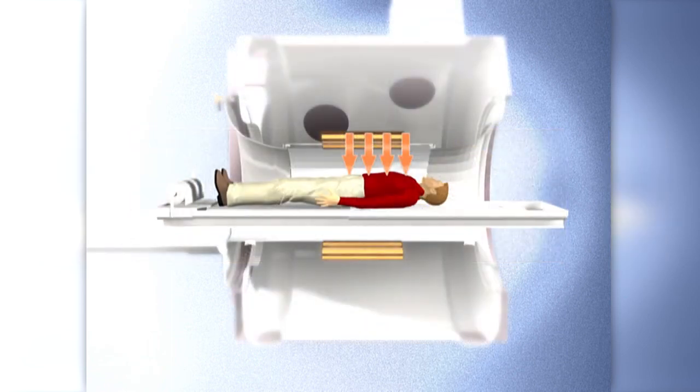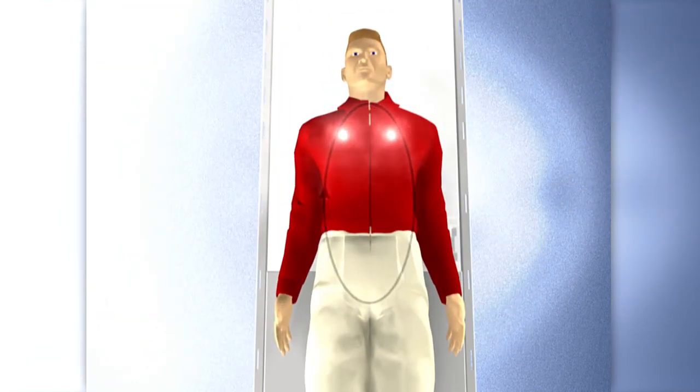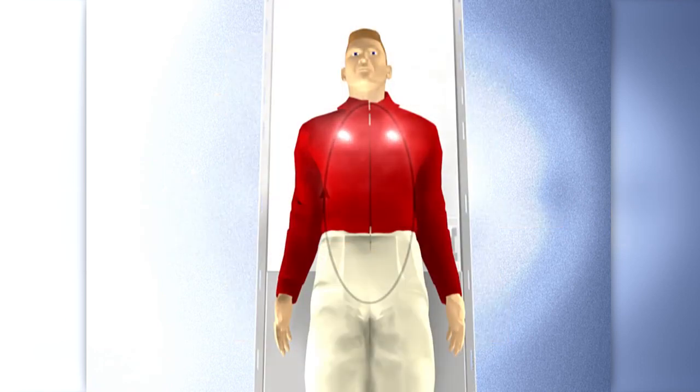In rare cases, quickly switching on and off the magnetic gradient fields can induce electric voltages in the peripheral nerves. These harmless voltages are expressed as a tingling sensation or mild muscular twitching. However, our MR systems are equipped with safety devices for controlling the switching speed and strength of the gradients to prevent nerve stimulation.